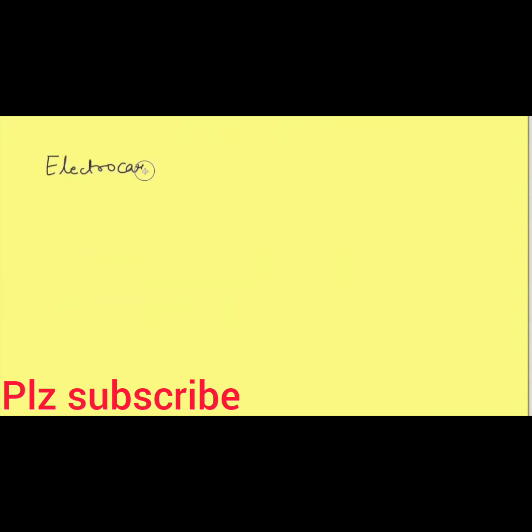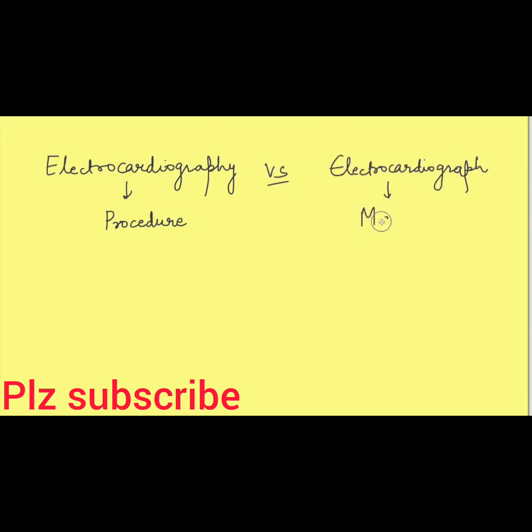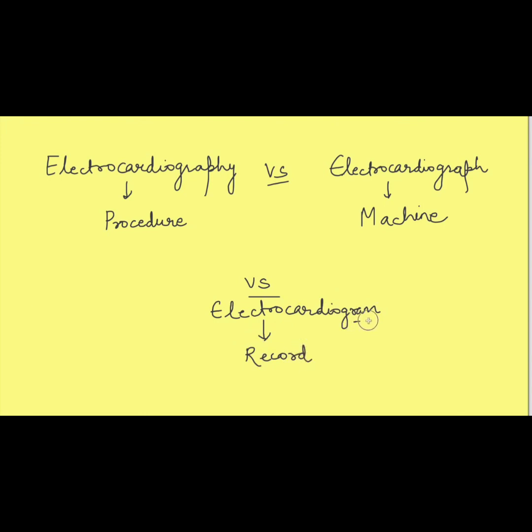So, electrocardiography is the procedure of recording the spread of electrical activity in the heart. Electrocardiograph is the machine which is used to record this electrical activity, and the record which is obtained is known as electrocardiogram. Don't confuse, the record obtained is not known as graph, it is known as electrocardiogram. The machine is known as electrocardiograph.